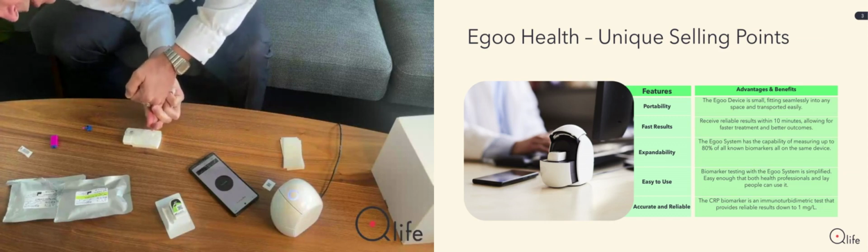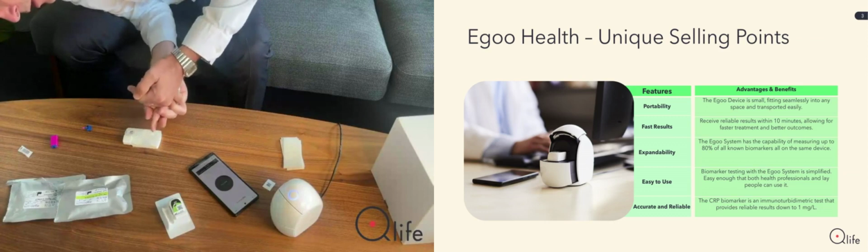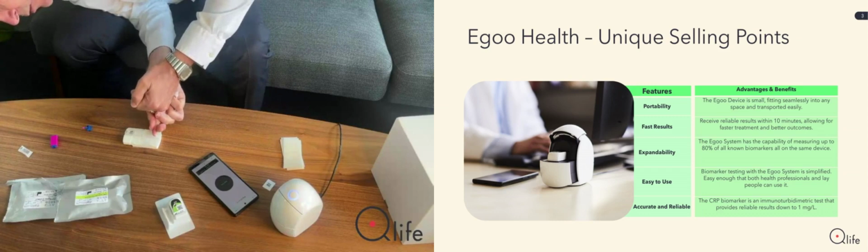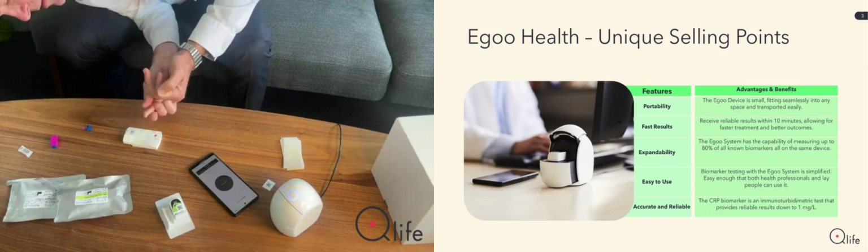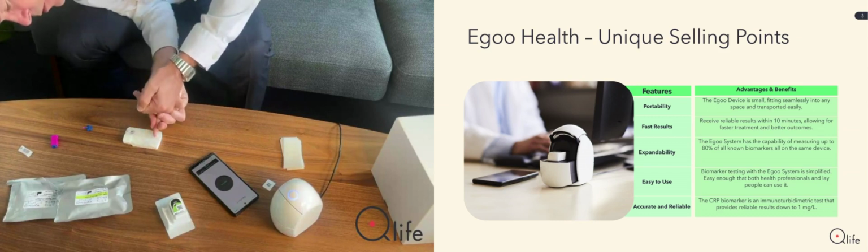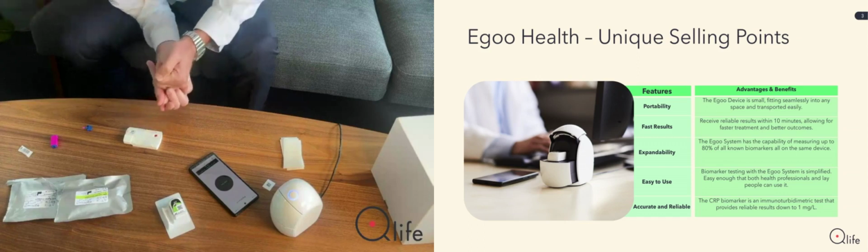And I can see today I don't have so much blood in me, but here it's coming. And then down. It looks good. Yeah, it looks good. And then down. Can you see the membrane absorbs the blood immediately? Yeah. And that's actually enough. But let's put a little bit more on it. So now it should be enough.